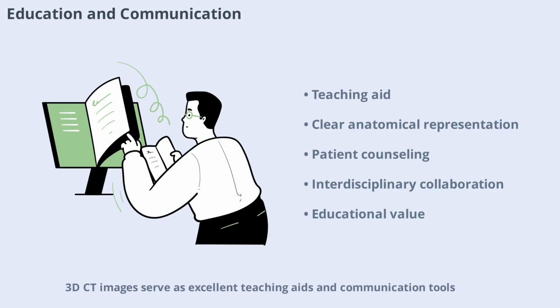3D CT images serve as excellent teaching aids and communication tools. They provide clear, life-size representations of anatomical structures, facilitating understanding among students, clinicians, and patients. The images can be used for education, patient counseling, and interdisciplinary collaboration.